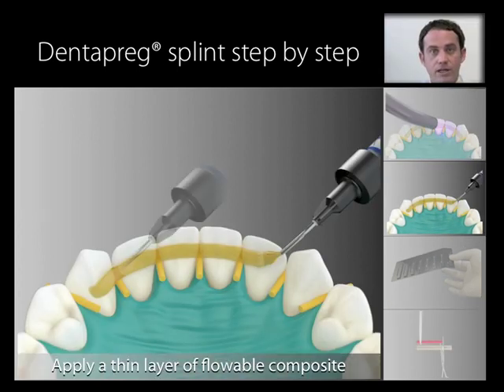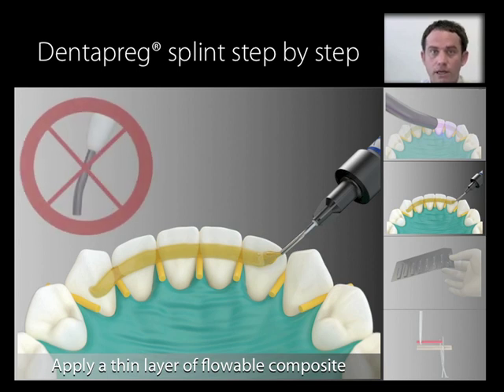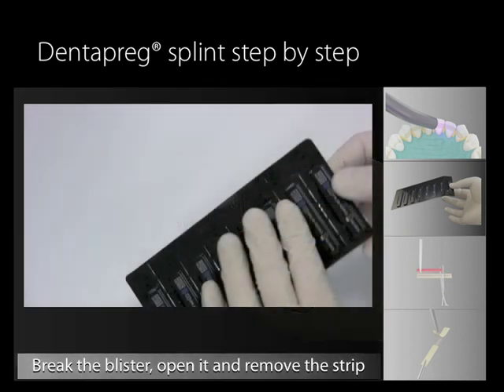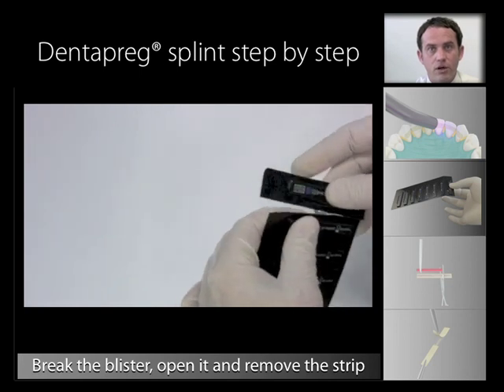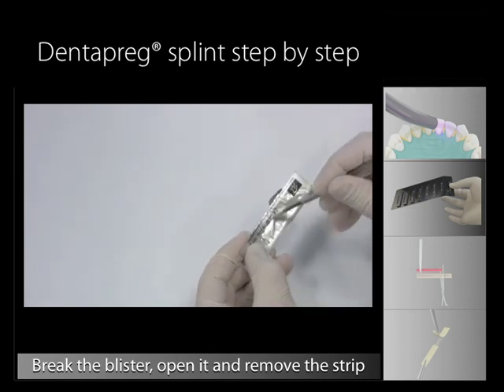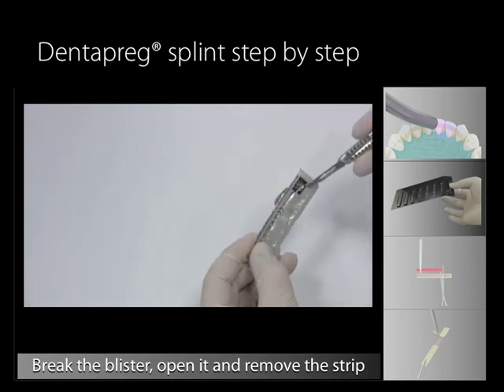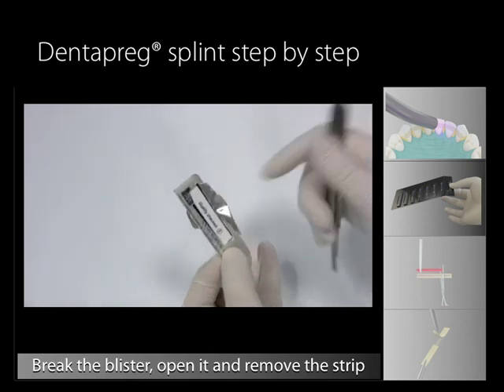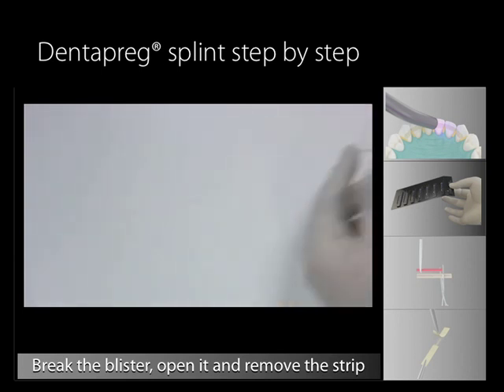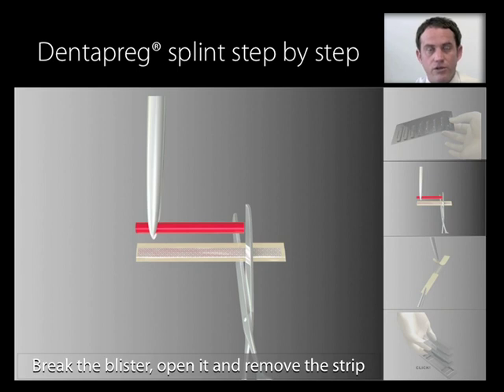Cover the bonding area with a thin layer, about half a millimeter, of flowable composite. It's important at this point that you do not cure. Thanks to the chemical compatibility of Dentopreg, you can use whichever light-curing flowable composite you prefer. Then break the blister to separate one compartment with the strip, open the aluminum cover of the compartment, and remove the strip.